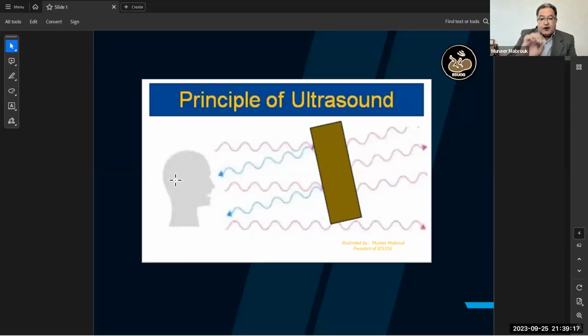This is very important in your transducer in your hand. It sends sound to the body, and the body reflects the echo back. Now, this probe should give me a pause after sending the sound, just to allow the echo to come back to the machine.